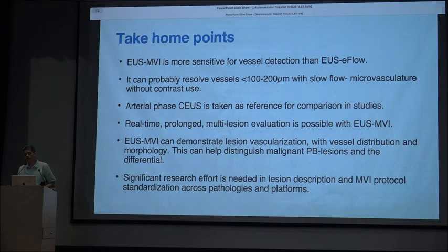Real-time, prolonged, multi-lesion evaluation is possible, and this is one advantage over contrast. EUS microvascular imaging can demonstrate lesion vascularization, distribution, and morphology, and this can narrow the differential. Obviously, this has extensive application in liver SOL characterization, and we need significant research to standardize the protocols.